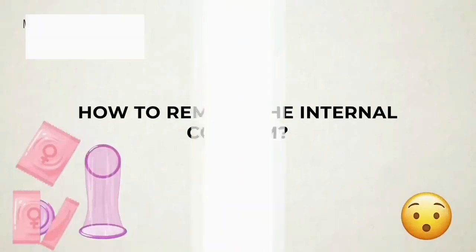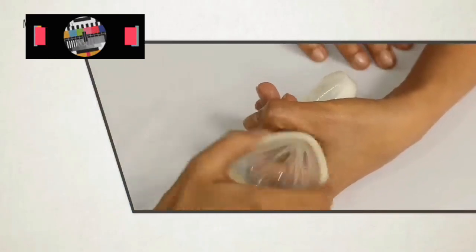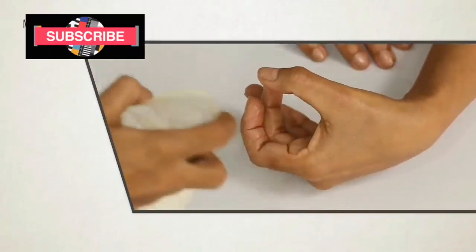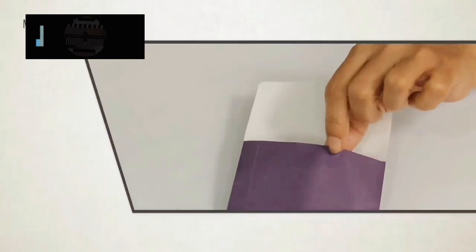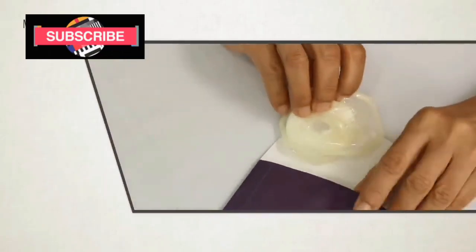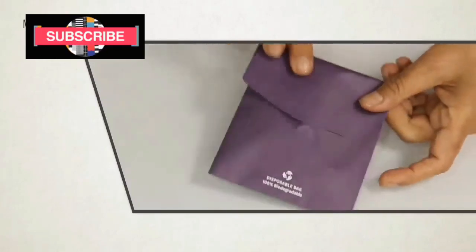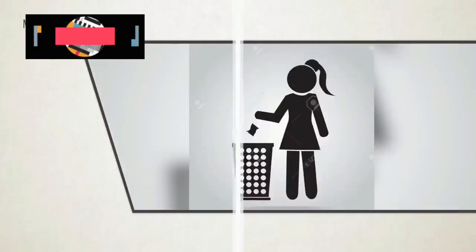Now, how do we remove the internal condom after sex? Just twist the outer ring and carefully pull it out from your body to make sure there is no leakage. Now, how do we dispose the condom after use? Most female condoms come with a pack. So after use, pull it back inside the pack and carefully seal it up, wrap it in a paper. Do not put it in the toilet, but put it in a bin.